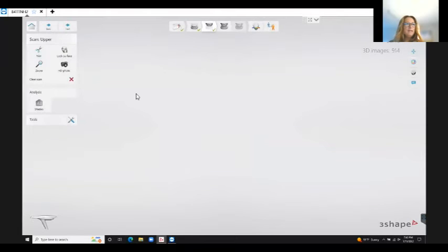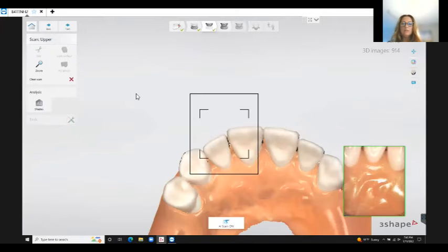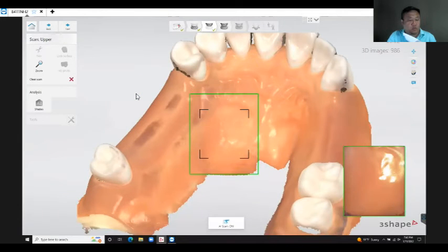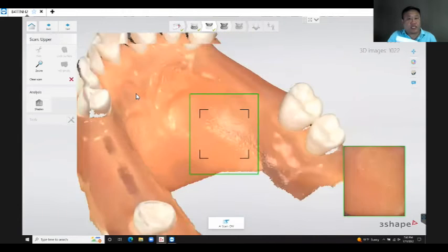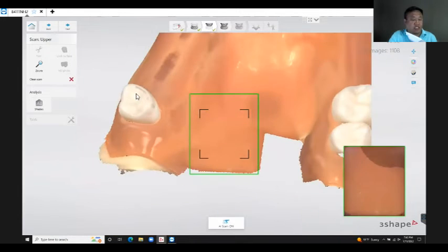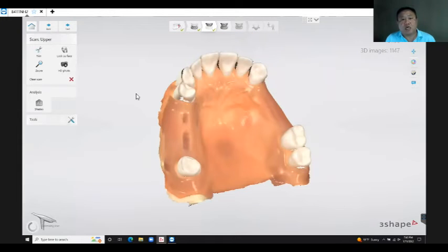And Bannister, do you find it easier to turn AI on and off in those large spans? What I usually do is I try to scan with the AI on first. If the scanner is struggling, that's the time that I'm going to turn it off, just while I'm scanning the tissue.